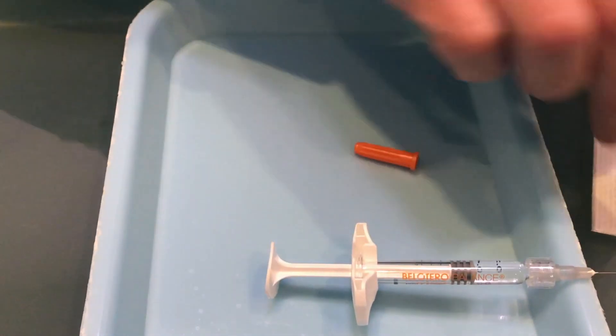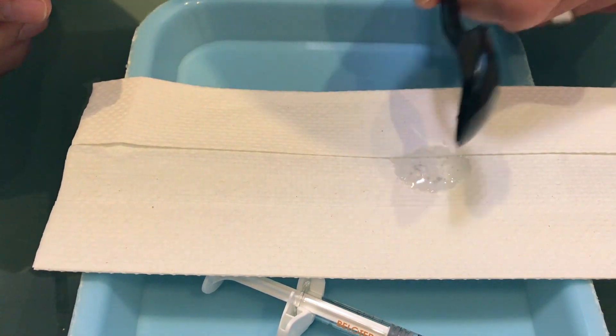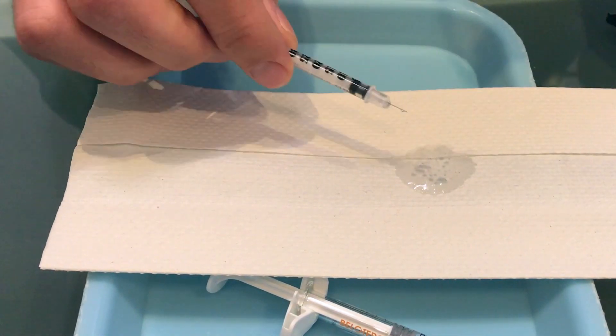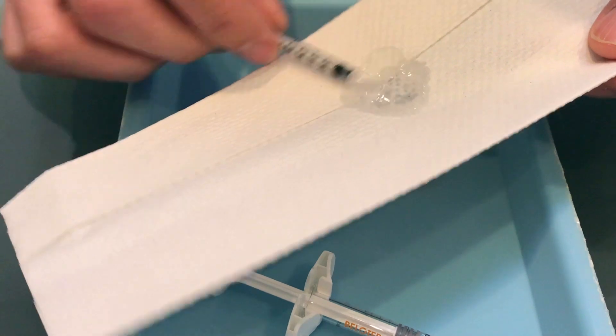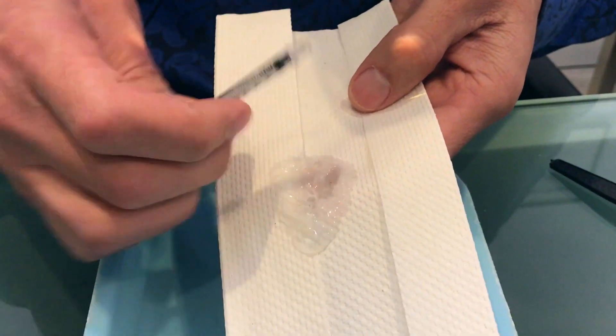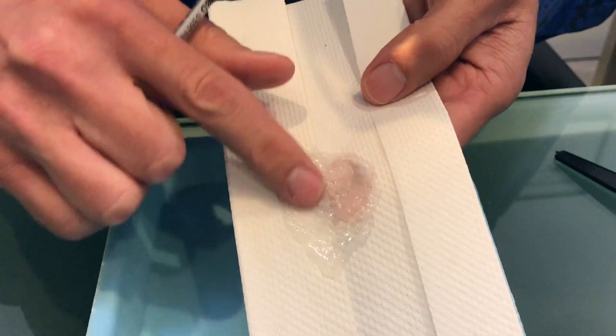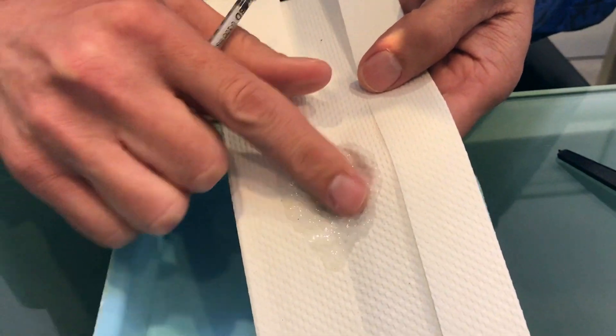I'll just put this on a napkin to just kind of show you that it really is gone at this point. There's no real filler left. Maybe a little bit.